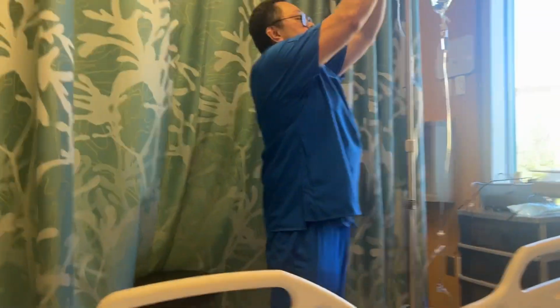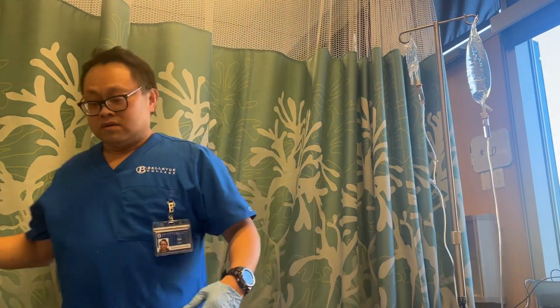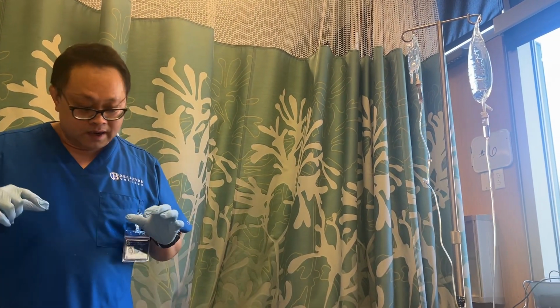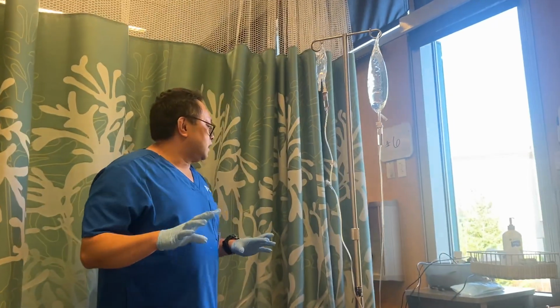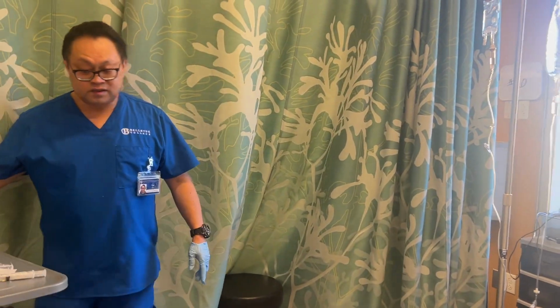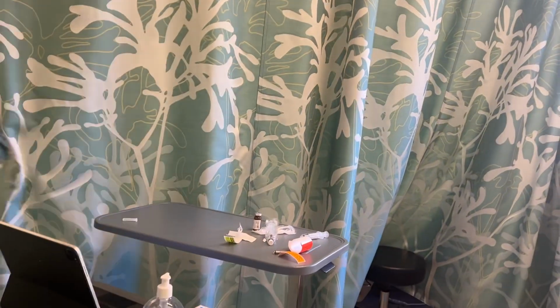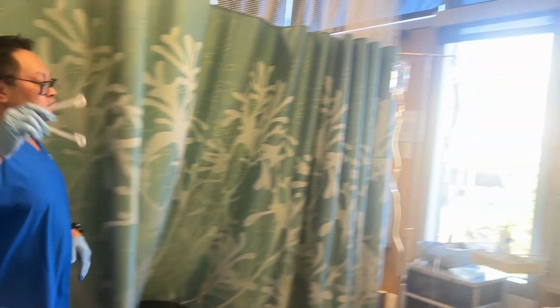I'm going to lower the secondary bag, and please forgive me because this is old material. I'm going to get this piece. I'm going to lower the secondary bag.